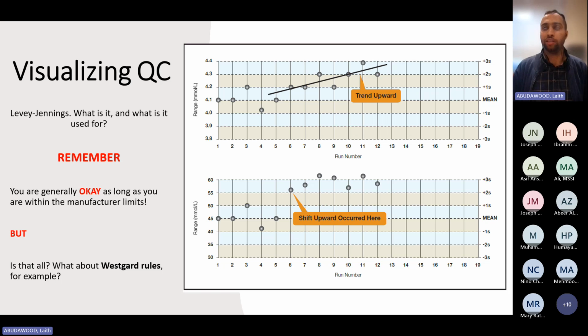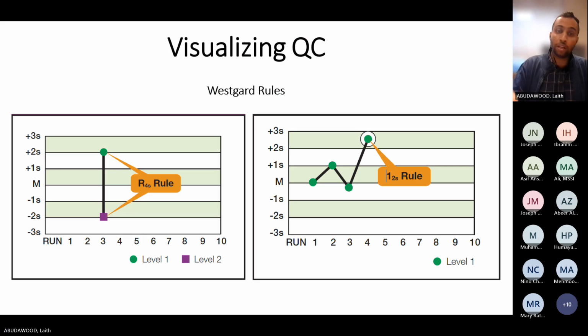I'm sure all of you have heard about Westgard rules. Westgard rules, in part, help you to assess: when I look at the LJ graph, and I have this many runs higher than this much value, or 1 run higher than this much, or 3 runs increasing, or 3 runs decreasing, for example, then I have an issue that I have to investigate. If I have just 2 runs decreasing, then there is no problem to investigate. This is how Westgard rules work. However, you have to be careful, because this is just a couple of examples of Westgard rules. I just add them for your reference.